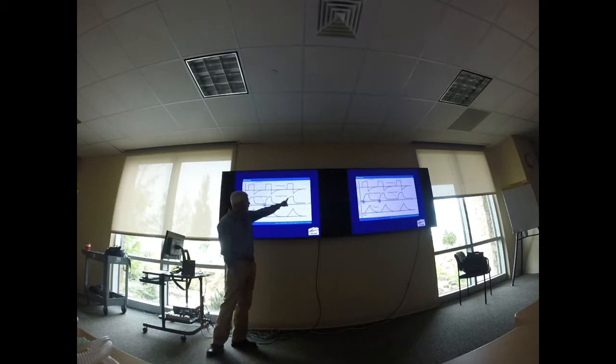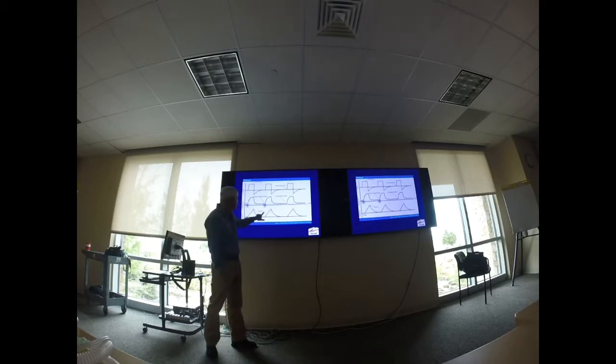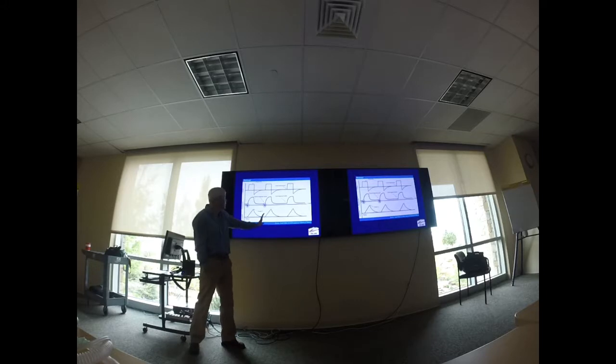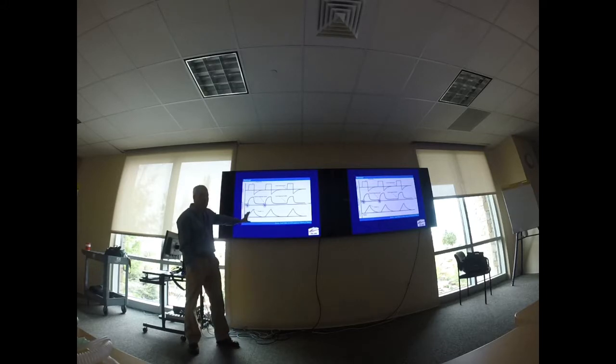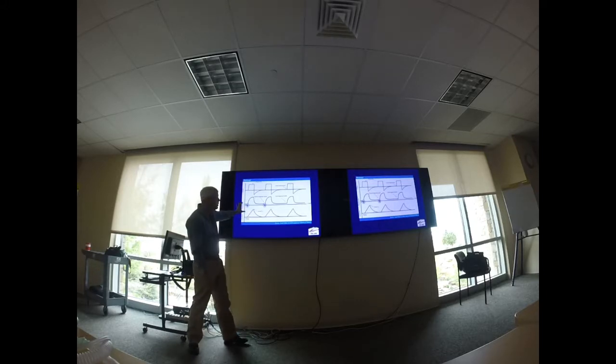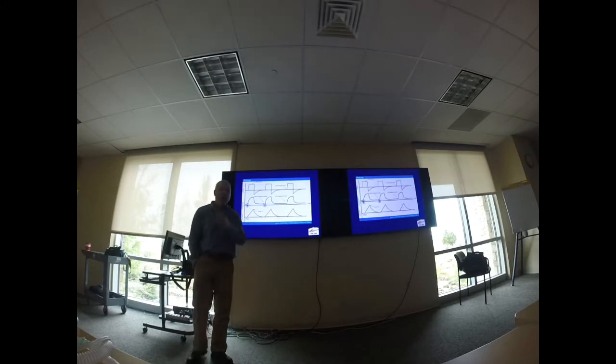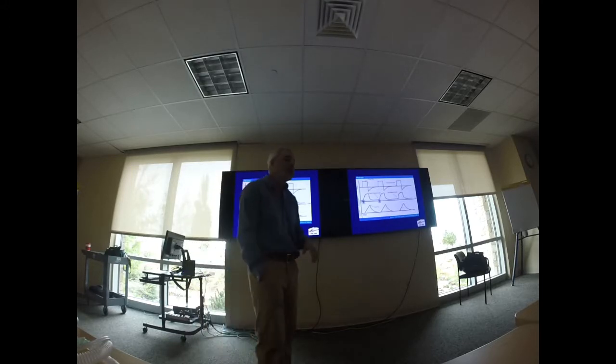And then this is a ventilator triggered breath. But you guys can see how everything is the same right there, right? So it doesn't matter if I had it set at volume or pressure, it's delivering the same thing regardless. That is assist control mode of ventilation, a graphic representation of it.